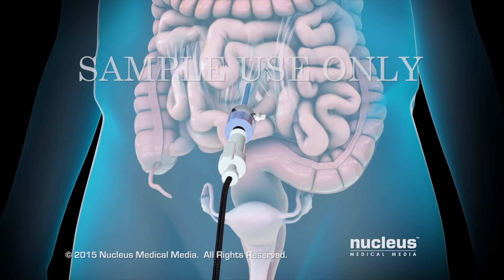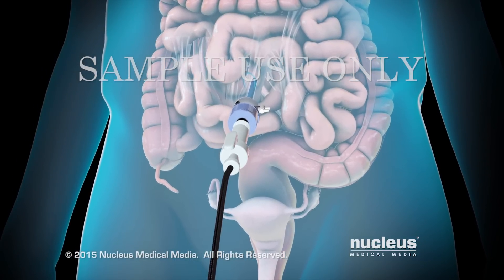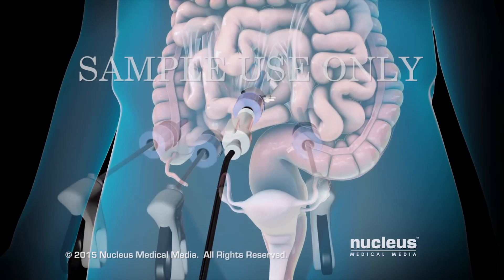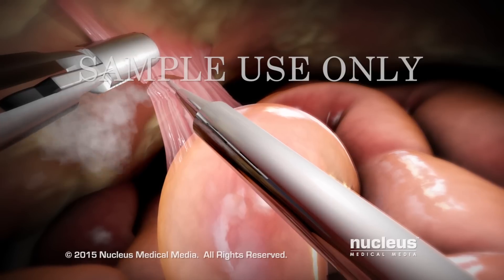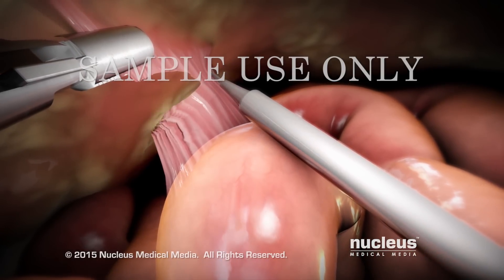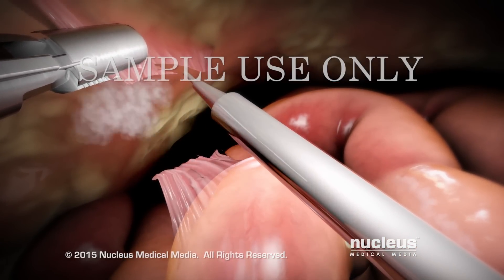After examining the abdominal cavity, your surgeon will make three or four small incisions in your abdomen, through which to pass surgical instruments. Using these instruments, your surgeon will cut the adhesions to free the organs from each other.